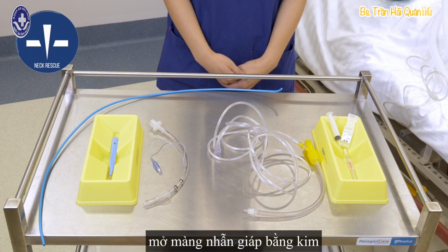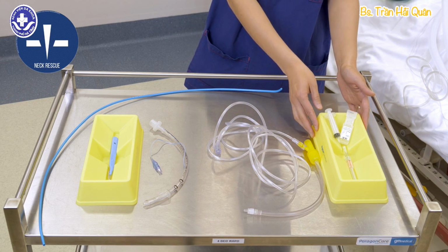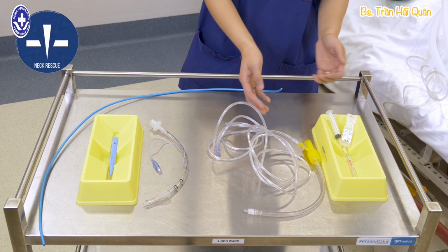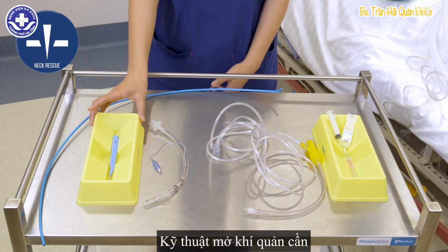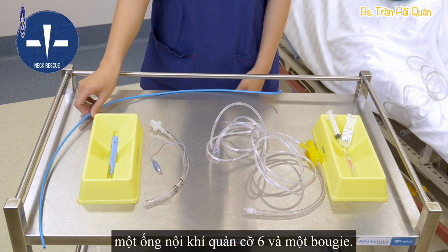The needle cricothyroidotomy technique requires a 14-gauge Insyte cannula, a 5 mL syringe, saline, and an oxygen insufflation method. The scalpel bougie technique requires a number 10 scalpel blade, a size 6 endotracheal tube, and a bougie.